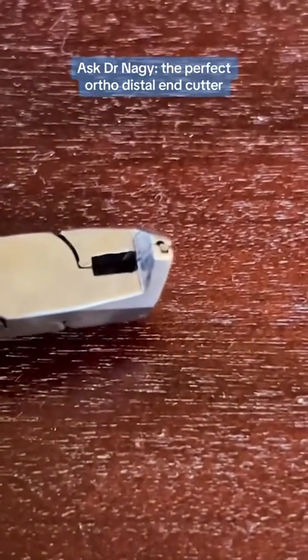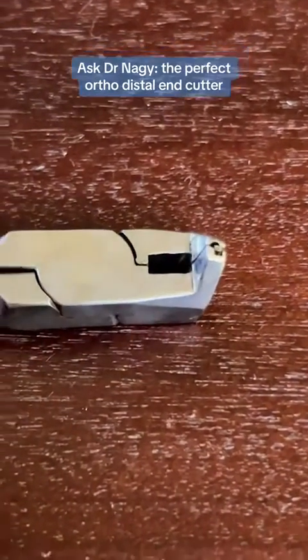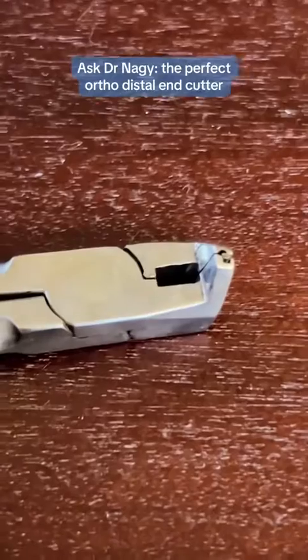So by far, this is my favorite distal end cutter. Try it out — OrthoArch is one company that actually makes these. Hope this helps. Bye.